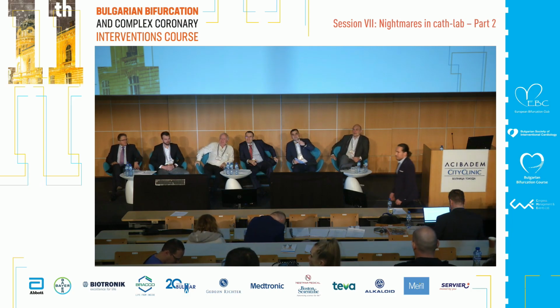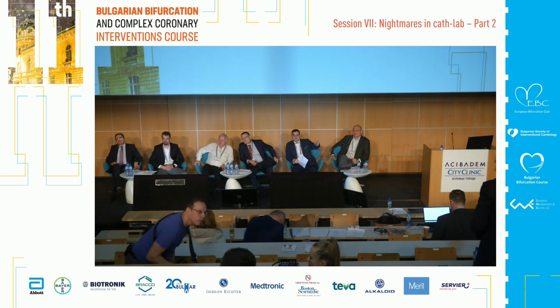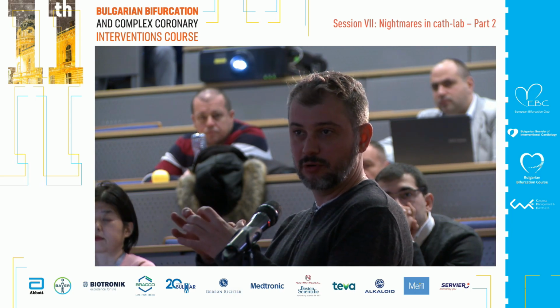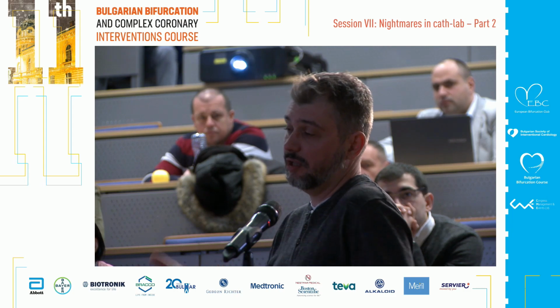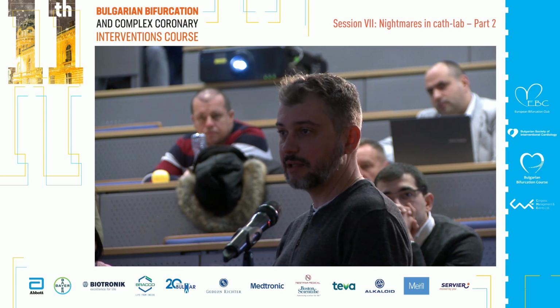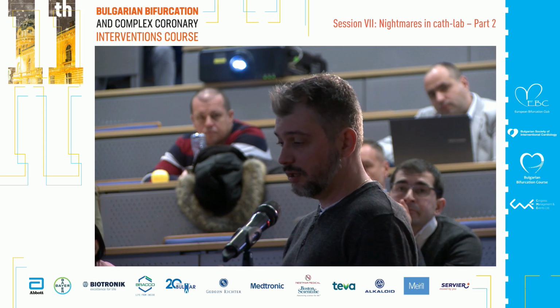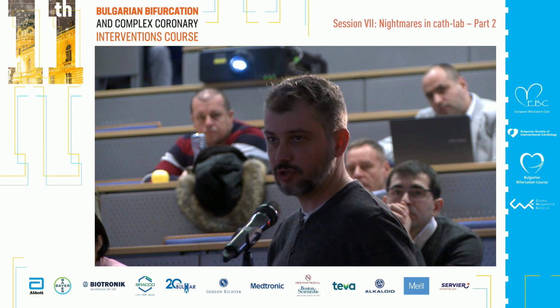Sasha? On the CT, it's a laceration of the wall, and the images we get from the CT, it's not a perfect hole, you know. So when you choose the device in a vessel, you oversize it like 20%, but we oversize it more, about 40% from the dimensions we had from the CT, to be sure, because it's a laceration. It's not a perfect hole. It's just for the size.